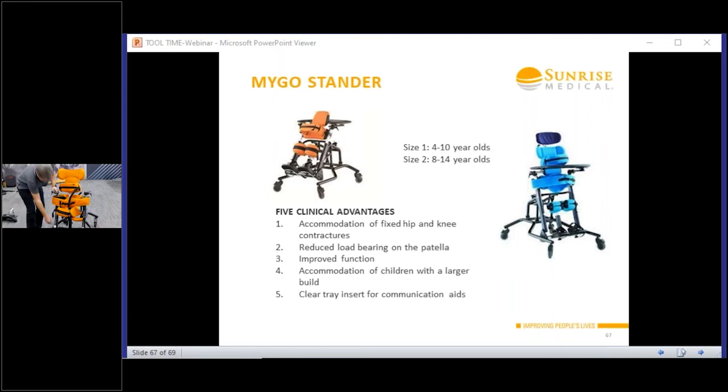And then height adjustment. So two spin wheels at the bottom for height. And then Rob's grown that at least a foot, probably two. Yeah, you gain this whole section here. You're gaining in height, and then you're gaining in the actual height here as well, chest height.